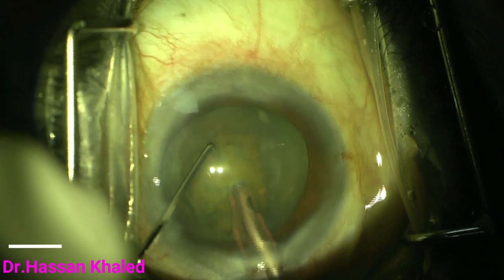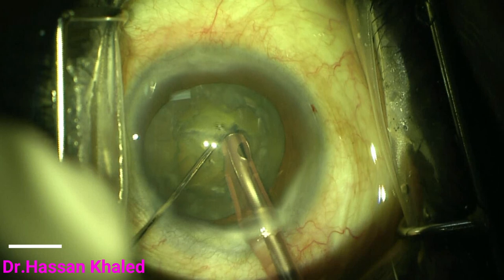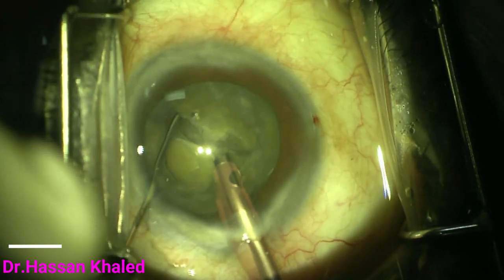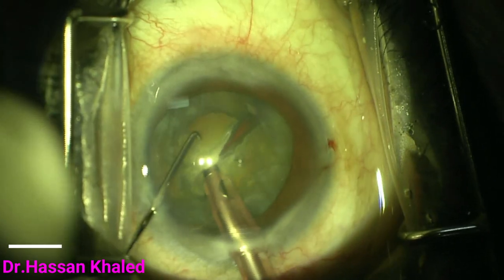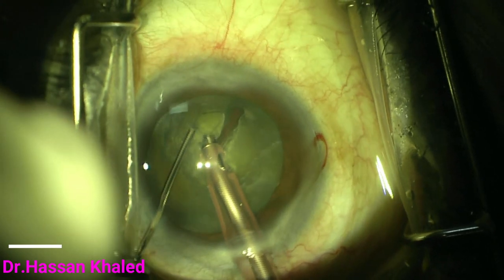I then impale the nucleus with the phaco tip, using a very sharp pointed tip chopper that descends right into the nucleus, creating a fracture that extends all the way back through the posterior plate. Then with sideways separation of the tip, the nucleus bisects completely in half.